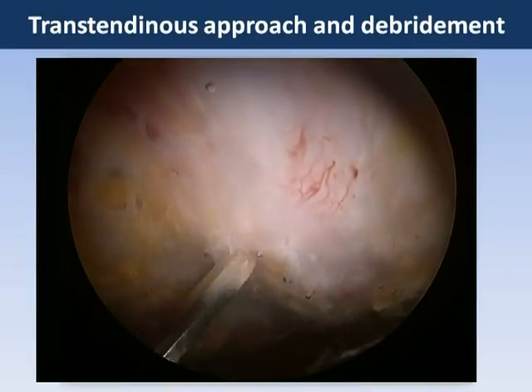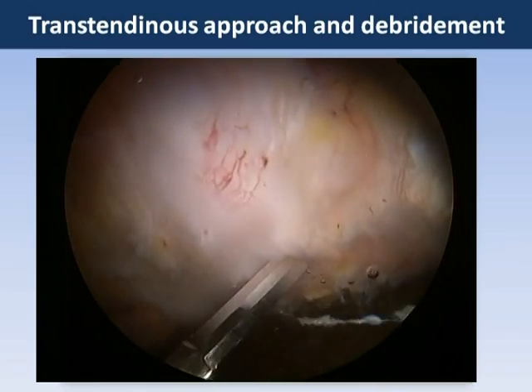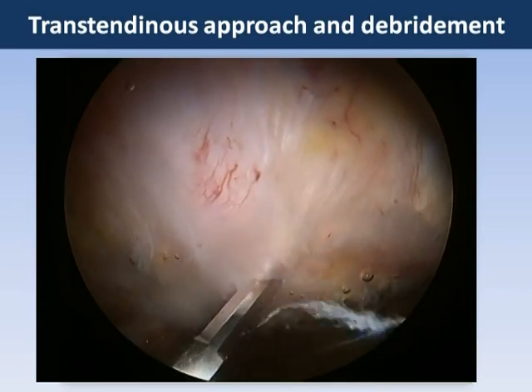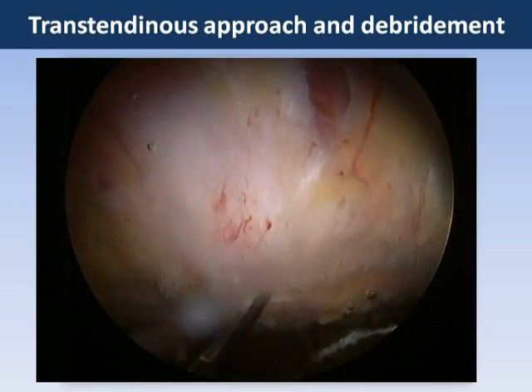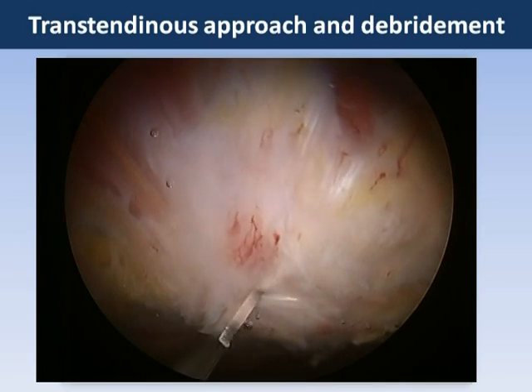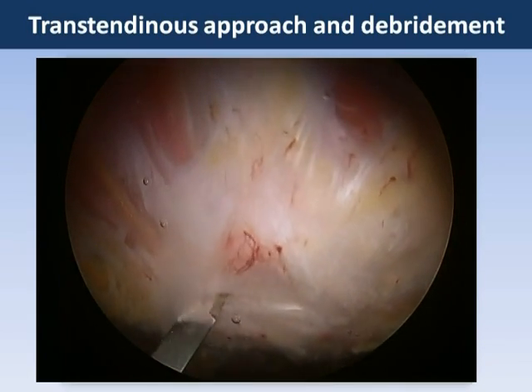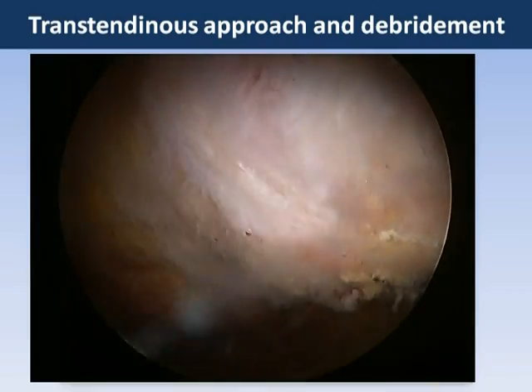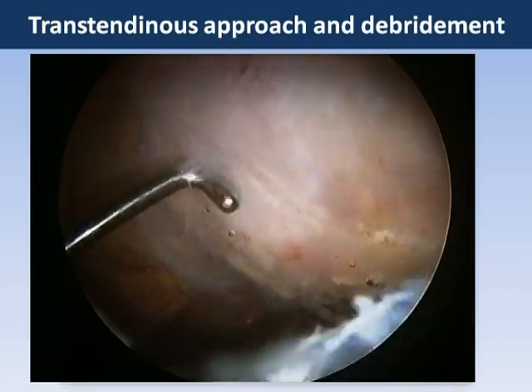The transtendinous technique employs a longitudinal incision made in the gluteus medius tendon using a beaver blade. From the peritrochanteric space, looking at the superficial part of the tendon, the tendon appears intact. However, the partial thickness tearing lies on the deep surface of the tendon. It is through this longitudinal split that we can access those deep fibers.